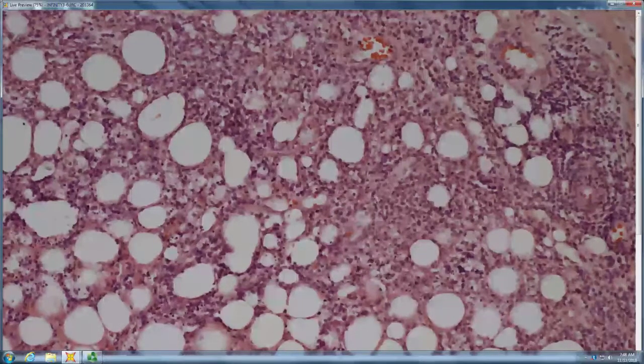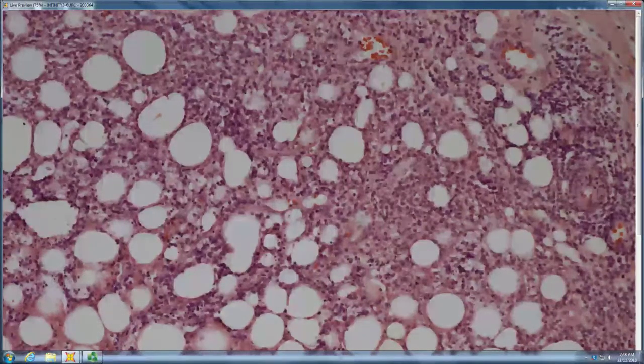Sometimes it's sterile because urine is being injected or other caustic agents. I've seen Liquid-Plumr injected. I mean, all sorts of things. And polarizing for bits of silica can help because often there is something extraneous in there that's a clue.